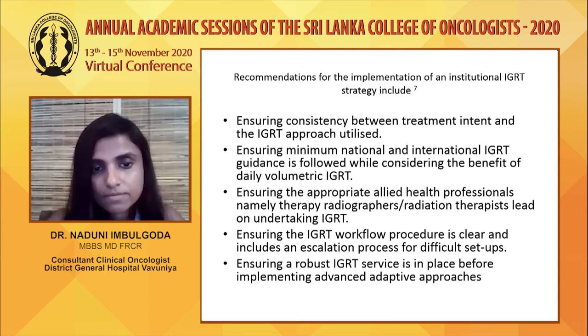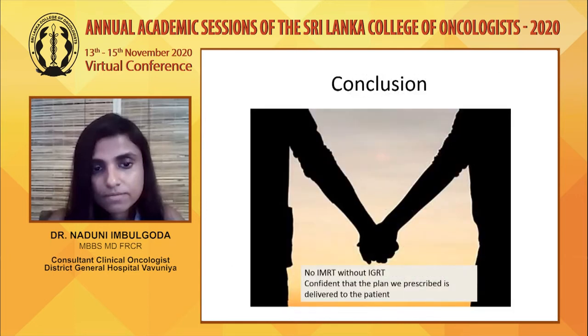So, in conclusion, we cannot have IMRT without IGRT. They always go hand in hand, and we have to always be confident that the plan we prescribe in IMRT is actually delivered to the patient.